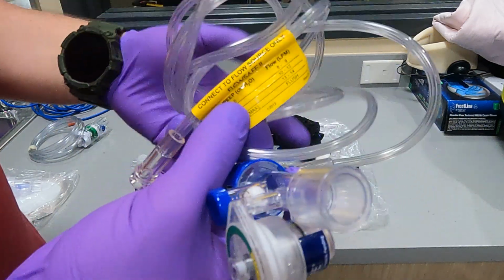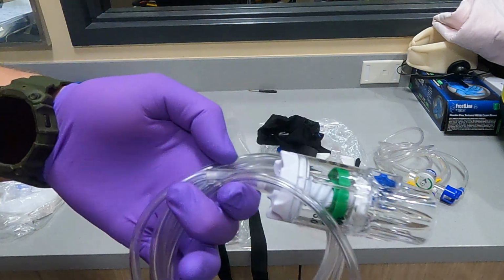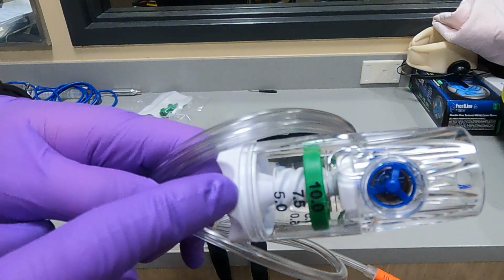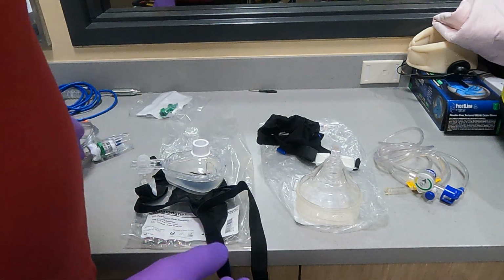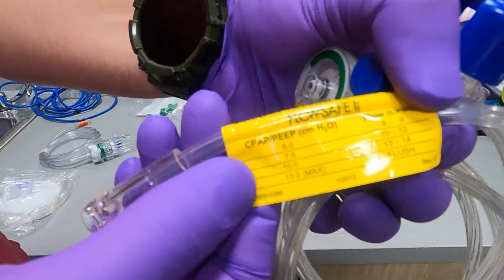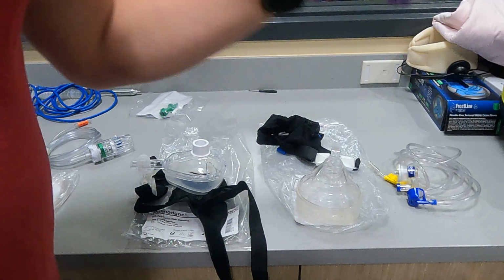This comes with a flow guide, which we'll go over. On the new one, it looks much different. This one has a dial a PEEP, so you can set how much PEEP you want just by spinning this, where with the old one, it is set with how many liters of oxygen you are putting through the device.